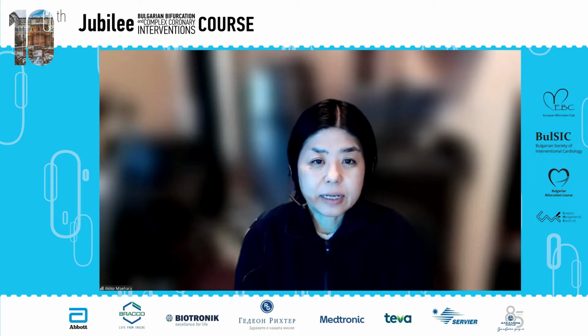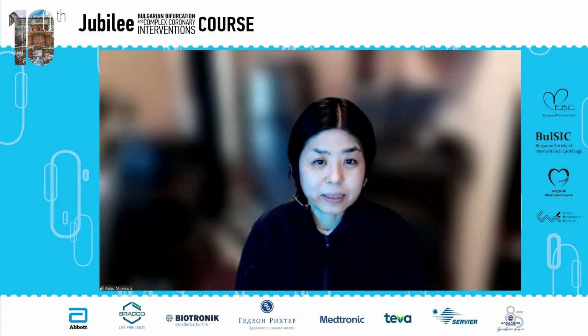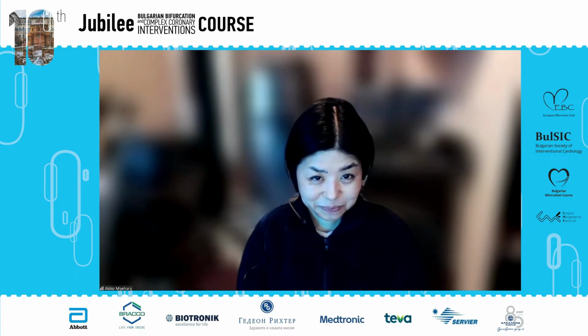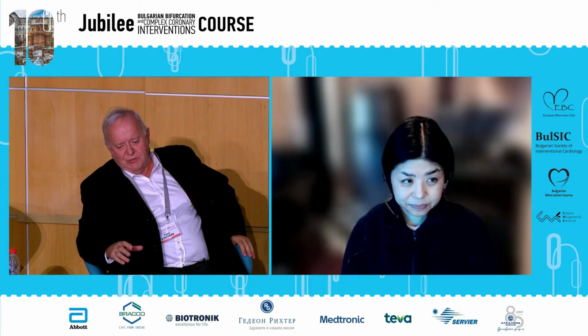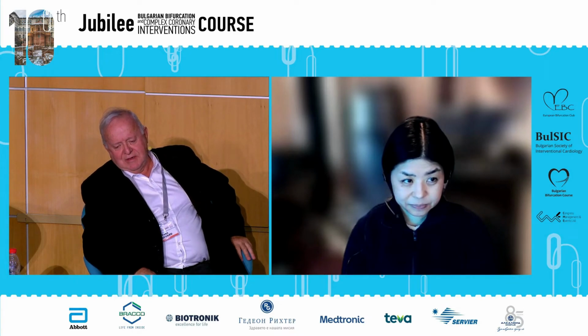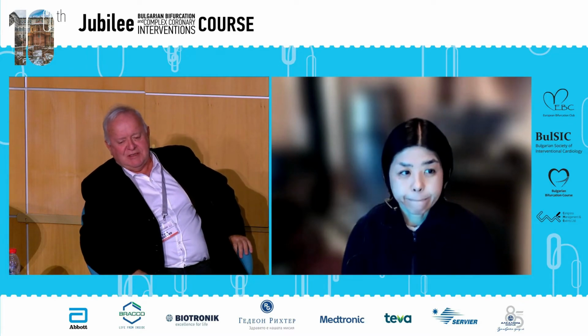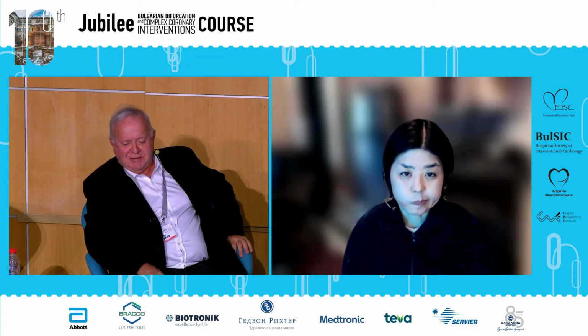So I think we try much. And it depends on the person, like you, we need a large area. Okay. Akiko, I remember an attempt, I've seen probably in Korea, an attempt to index these 3 diameters value individually on the patient status. Is it something we can do, or okay, we have to say he is Asian, so you have this diameter, he is a Texan, this is something different?